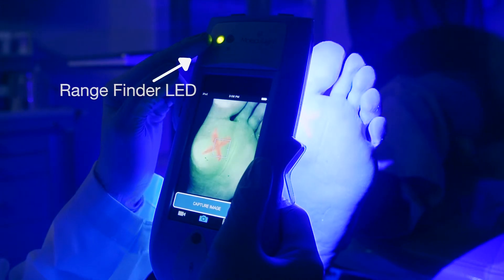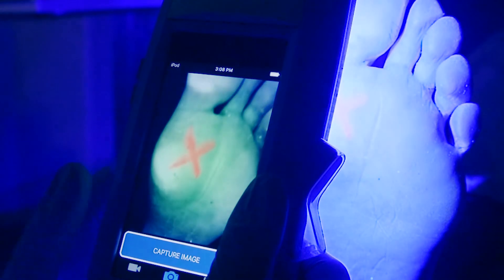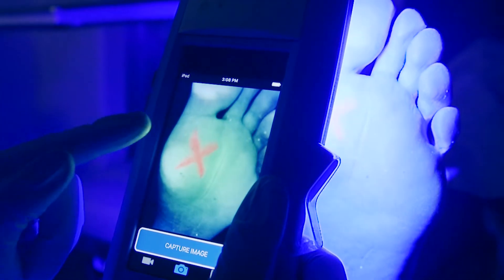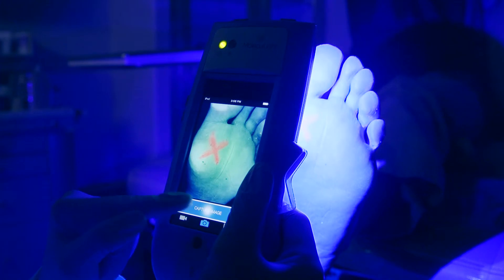Watch the rangefinder LED as you move the device to and from the wound. When the LED is green, you're all set! Once again, you can improve the autofocus by manually tapping the screen on the exact area you want in focus, and a focus square will appear. Then press the capture image button to take a still photograph.